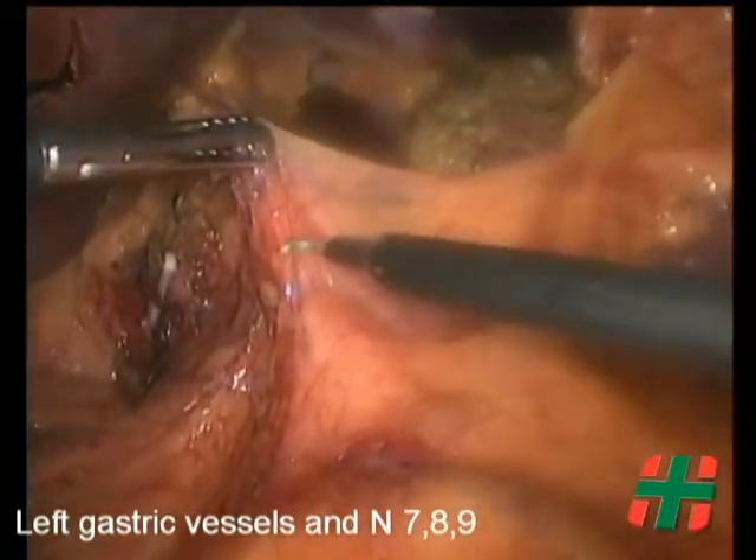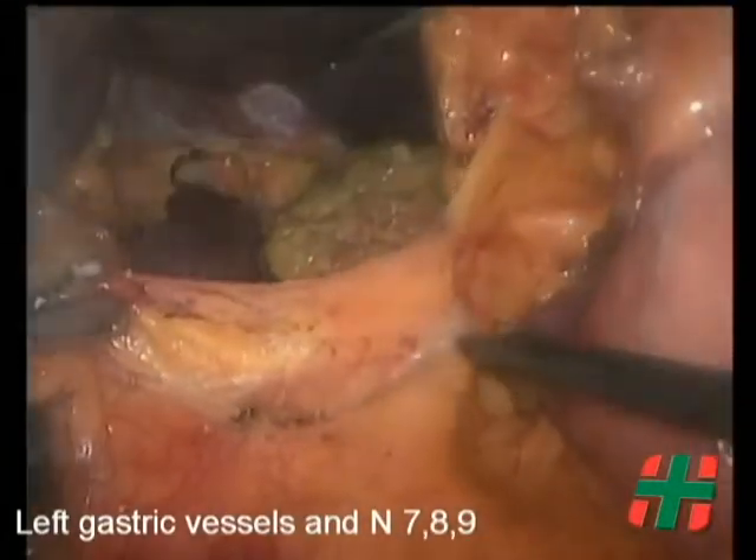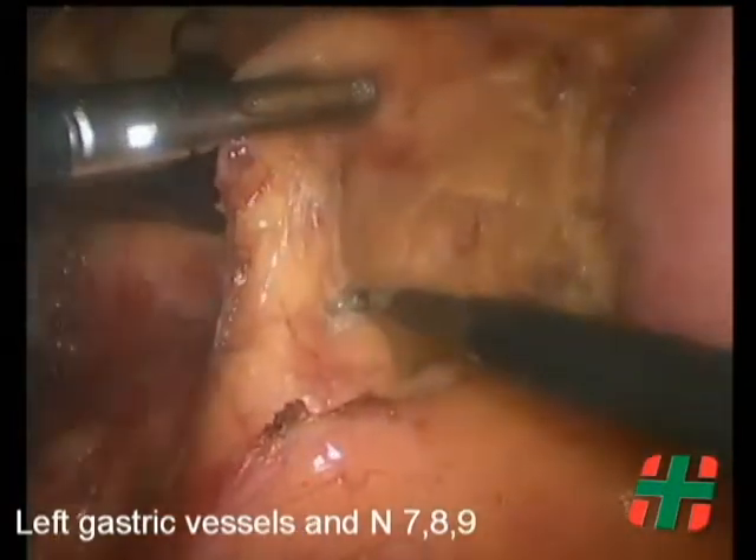Lymphadenectomy continues, starting cephalad to the pancreas and including nodes along the common hepatic artery, station number 8a, and the proximal splenic artery.